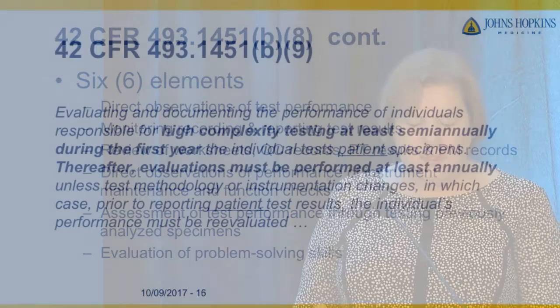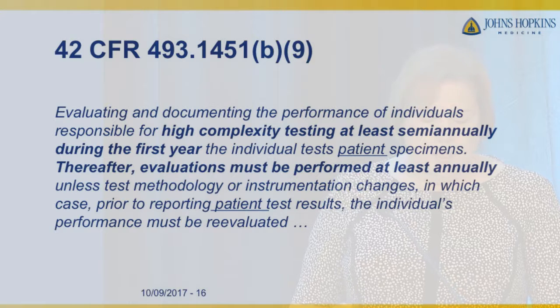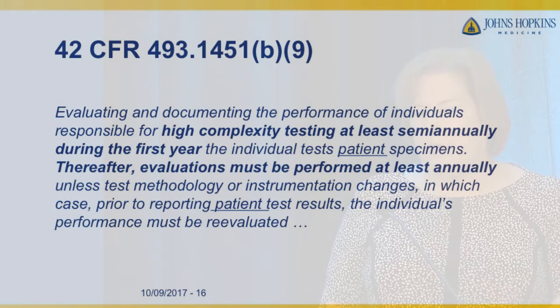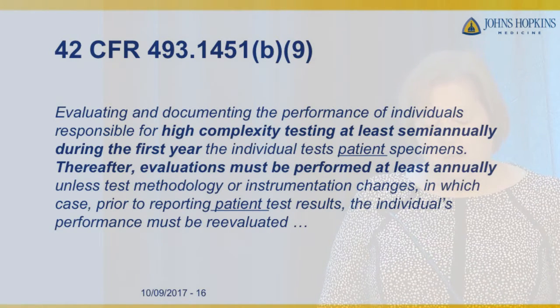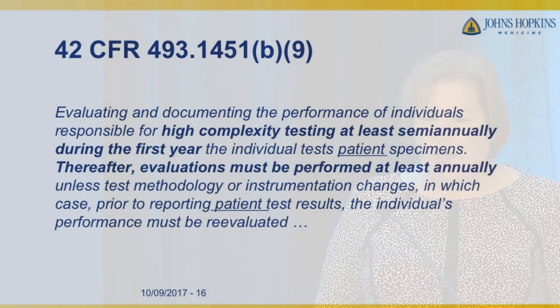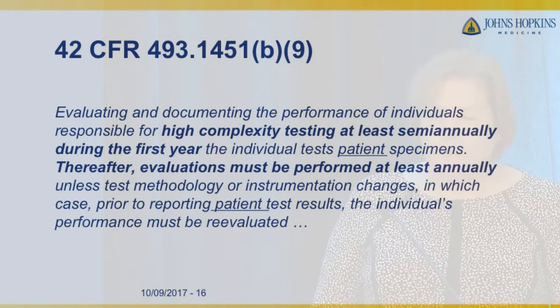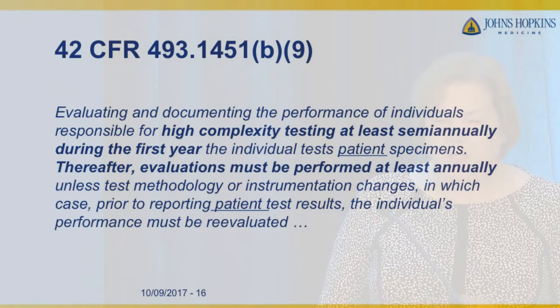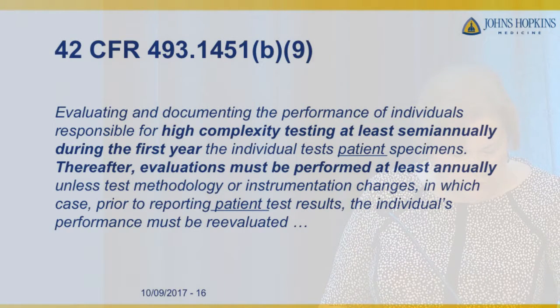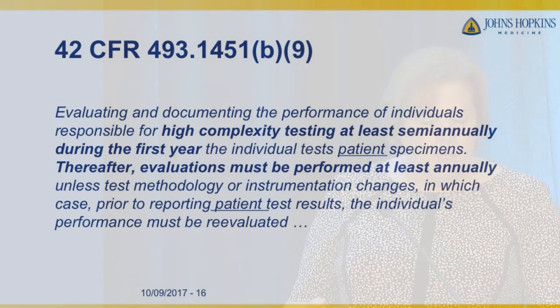Okay, so Part B9 describes the familiar part to all of us regarding the frequency of testing. Again, I'm not going to read this one to you, but during the first year, we have to assess competency at least semi-annually, and thereafter evaluations have to be performed at least annually. I'm not quite sure anybody would want to do it more than annually, but that word least is in there. It's definitely painful enough. Okay, so I think we're finished here going over the actual requirements.